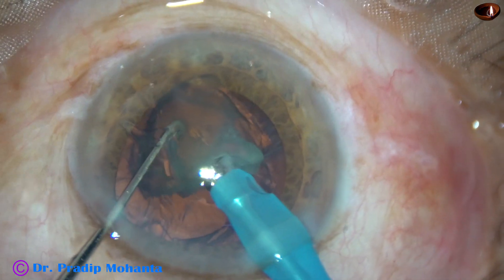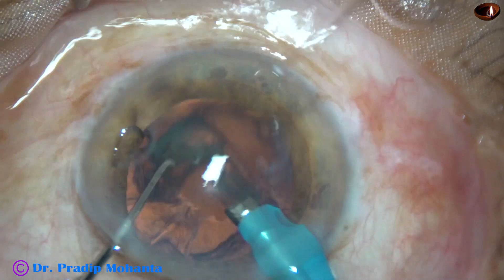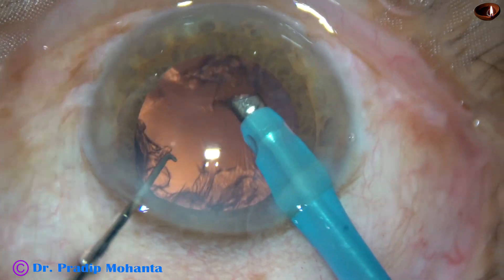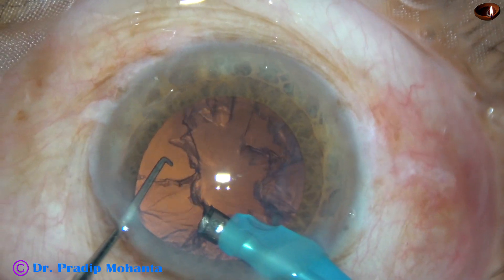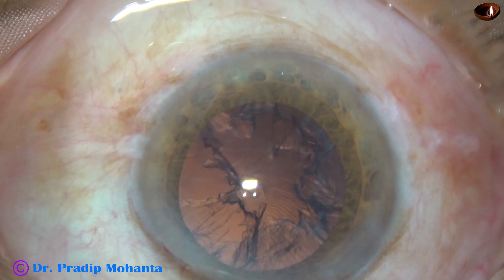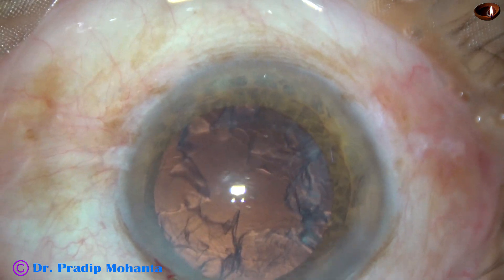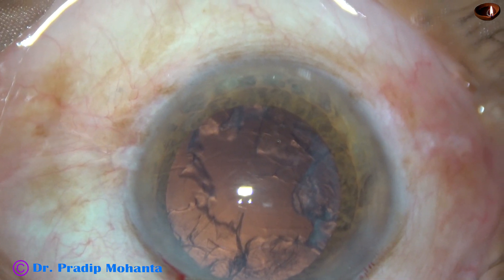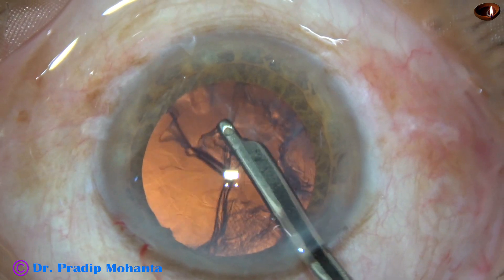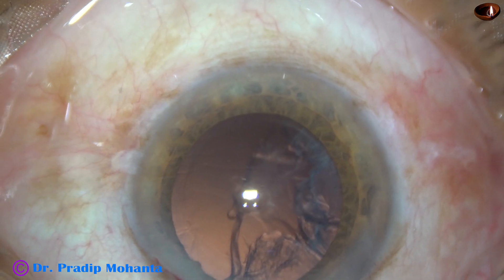And this is the last bit of the nucleus. You can see that at no point of time am I in a hurry — it is just as if the surgery is being done quite slowly. And now cortical cleanup is to be done. I take a Simcoe cannula attached to a separate Ringer's lactate or BSS and remove this half of the cortex.